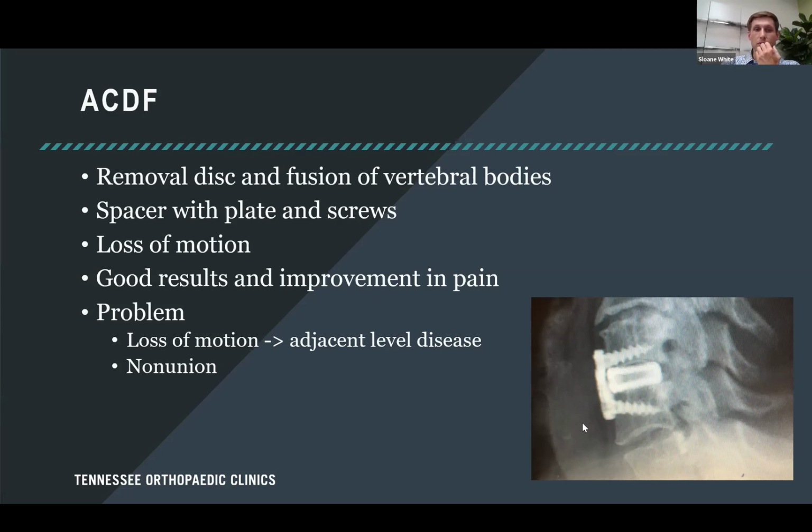Now, with the fusion, we lose motion at that level, and as you can remember from that chart earlier, there's a significant amount of movement at each level that contributes to the range of motion in your neck. However, all that being said, this is a gold standard procedure. Patients get very good results with this and good improvement in their pain. However, you have the loss of motion.